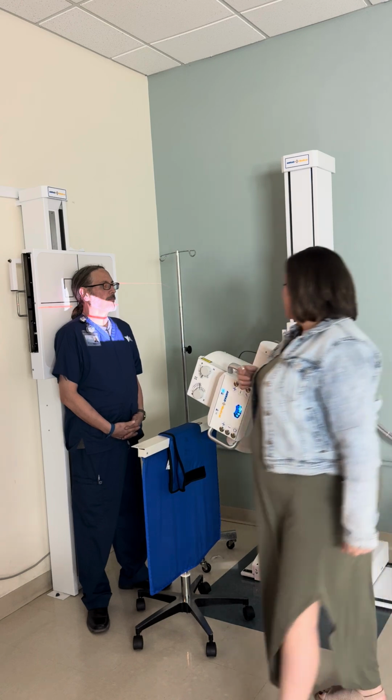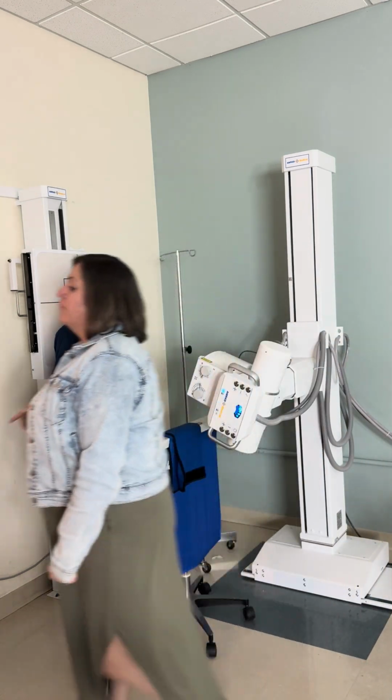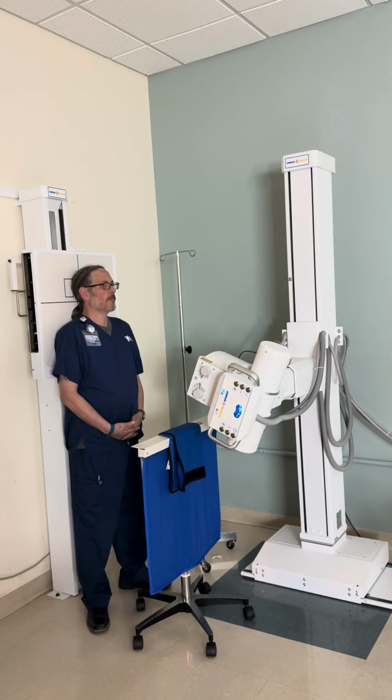The next view is going to be the open mouth view. So for this one, I'm going to put gloves on. 1, because I don't like people touching my face without gloves, and 2, I don't want to put my fingers behind people's ears without gloves.